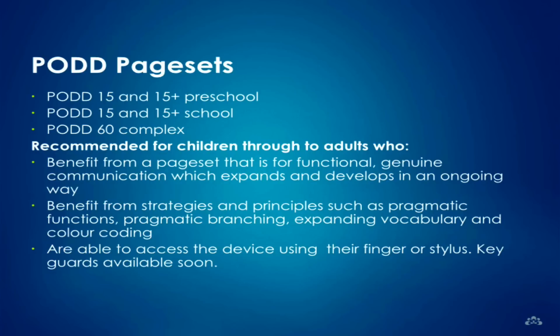So these ones are dynamic pages that are available on the Compass app. They're predominantly for people who are going to use direct access using their finger or stylus. There are some key guards available for this also.